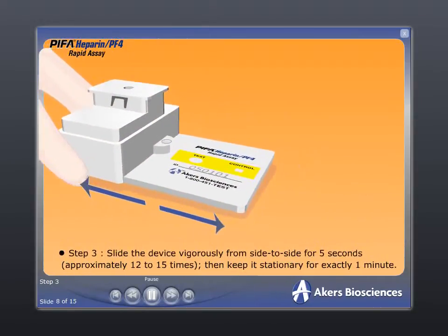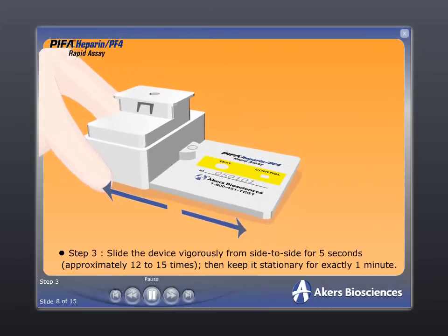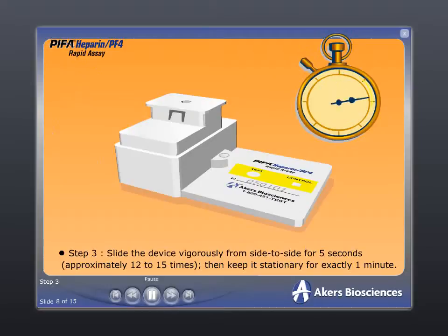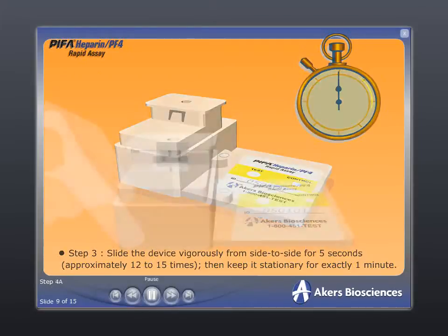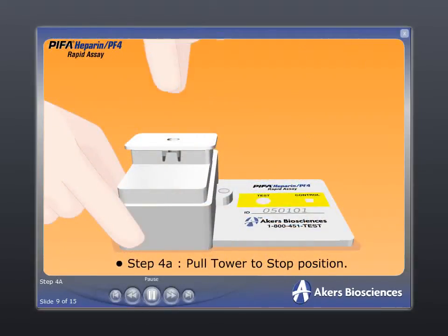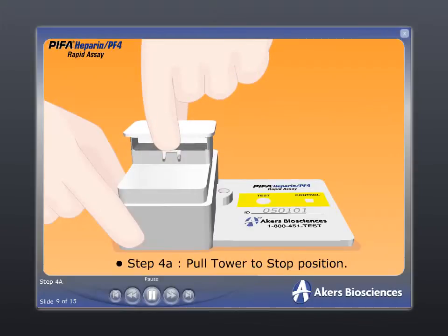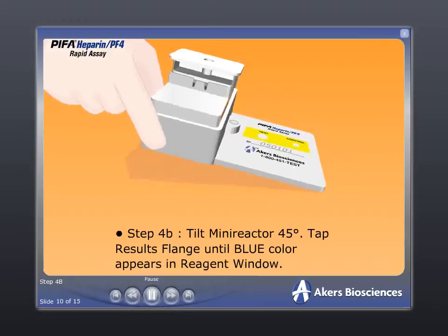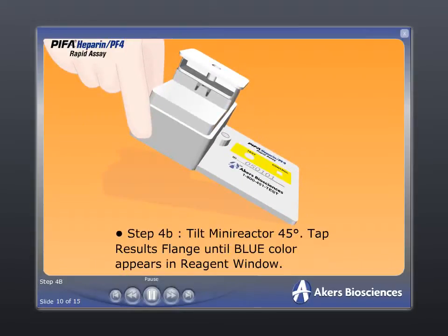Step 3: slide the device from side to side for five seconds, then keep it stationary for one minute. Step 4a: pull the tower up to the stop position. Step 4b: tilt the mini-reactor 45 degrees so that the tower portion is elevated.